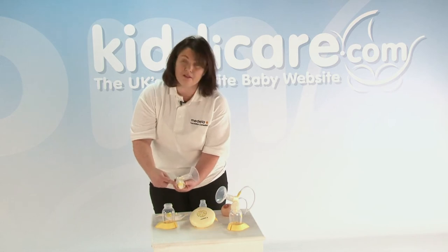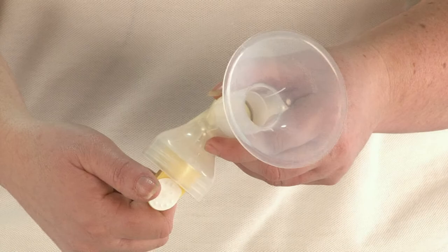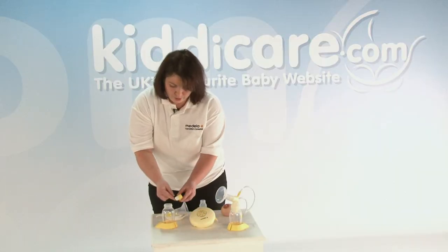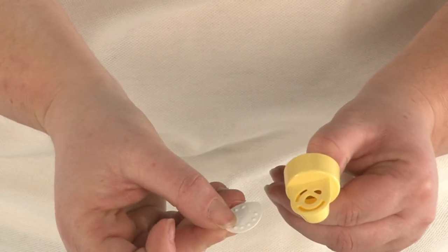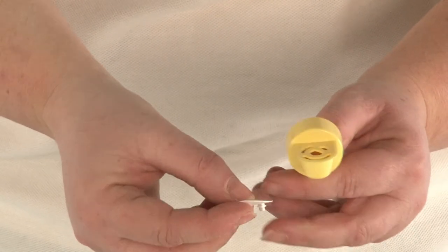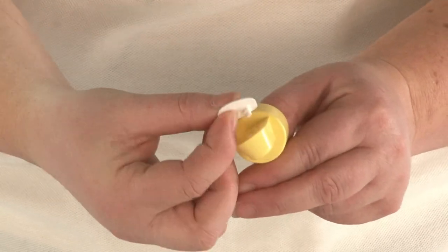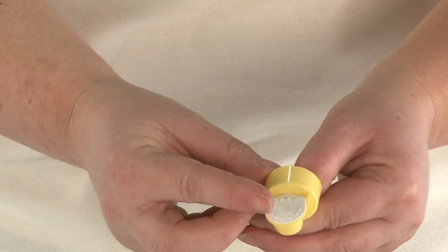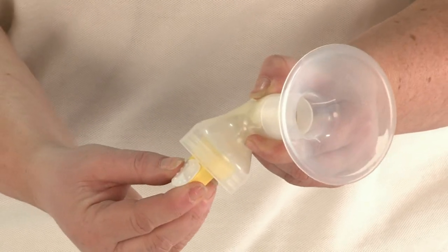And this is what I mean by the valve membrane. It does come off. When you do wash it, make sure that you're actually taking it apart and that your bottle brush goes into the centre of this. And when you put it together, check that you haven't got any holes or tears in it. Put it together again and screw it back onto the base, so it just clicks in there.